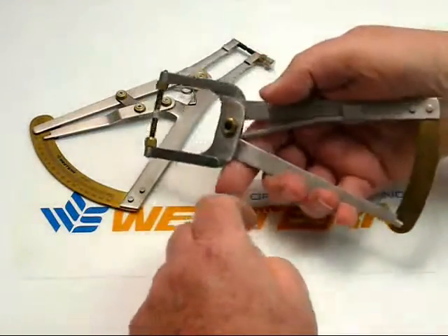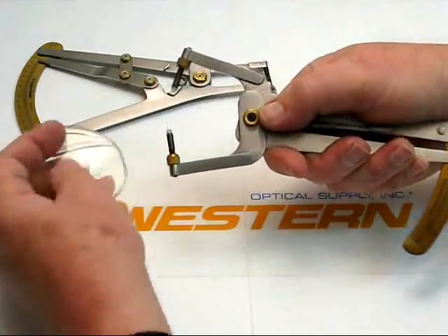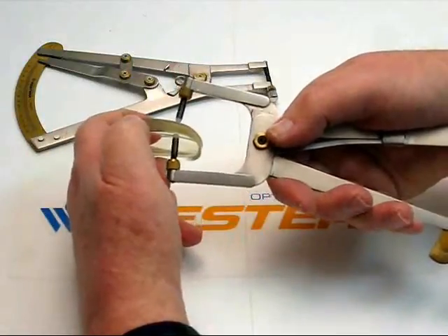The wide mouth lens caliper opens to a maximum of 25 millimeters. It's usually used in a surfacing environment where you're dealing with a large lens blank to start.